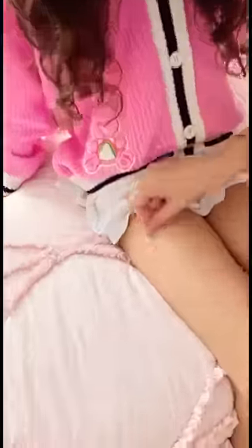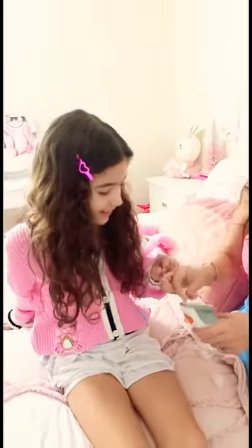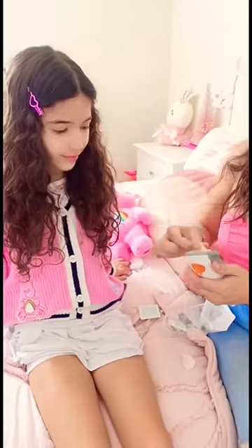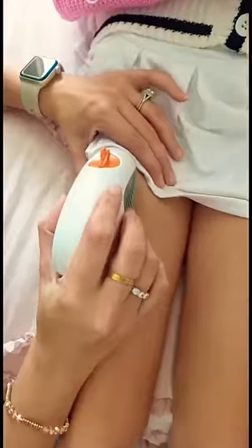We're going to clean the new spot. Okay, it's time to put in the new one. Want to peel that off? Put some extra glue so it can stick for the 10 days.